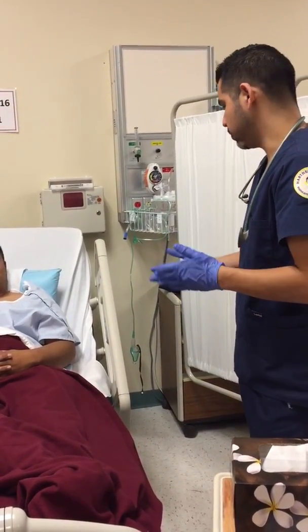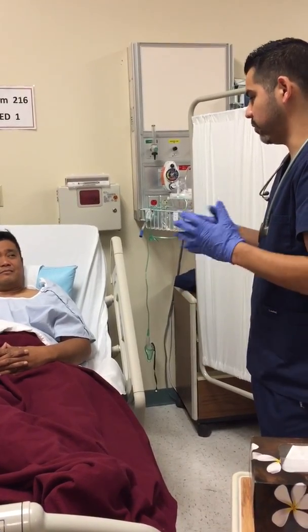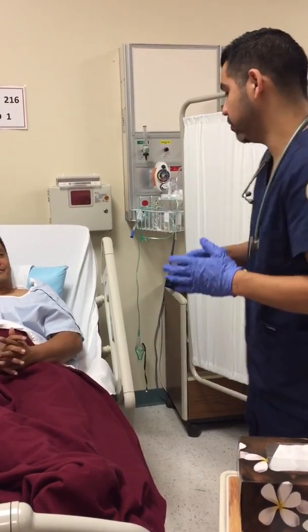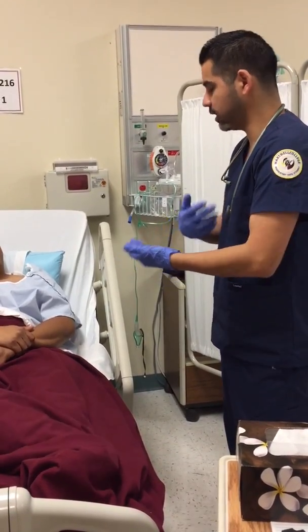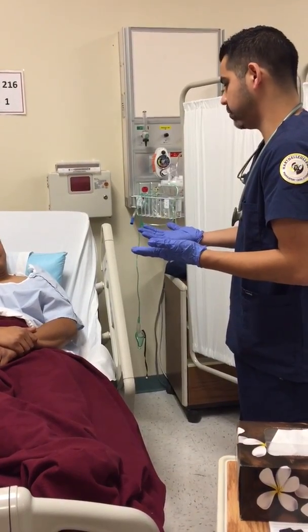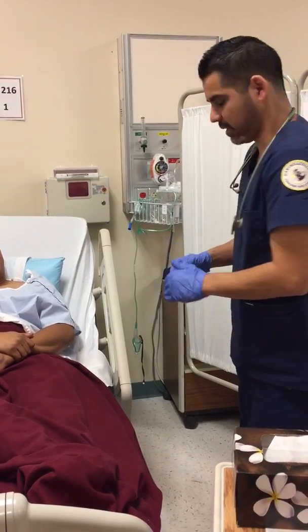And we'll be giving this once. If you ever feel like you need it again, you can always call me back, and then we'll give you another treatment. Okay? Do you understand everything so far? Yes. Okay. I do want to make note of some side effects you're gonna feel, like an increased heart rate and some jitteriness, and that means basically that the drug is working, but that's also a normal side effect. Okay? All right, so here we go.